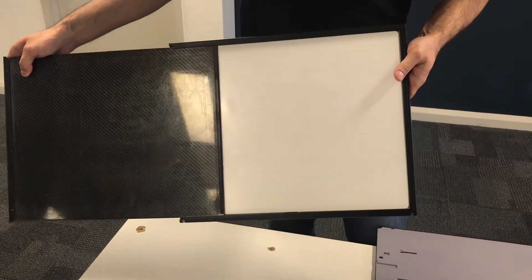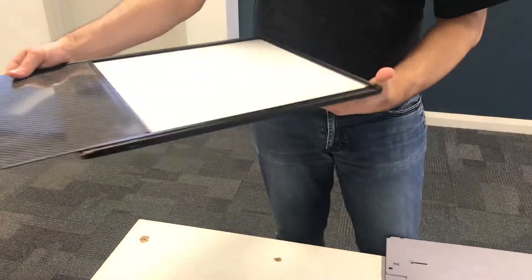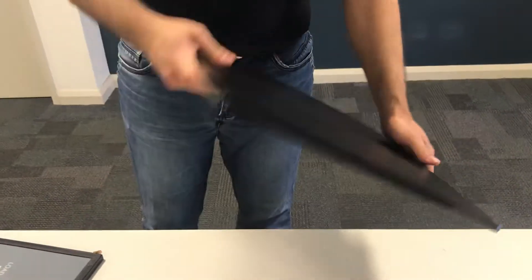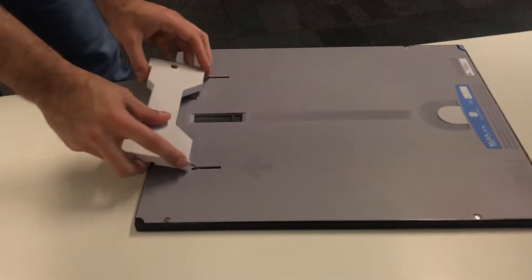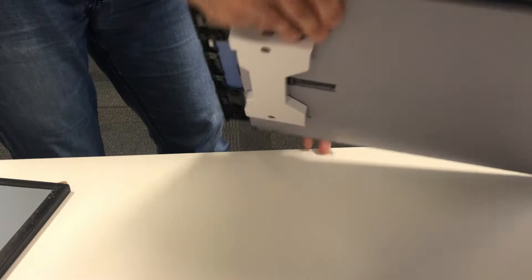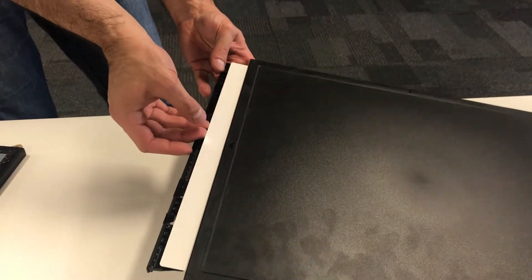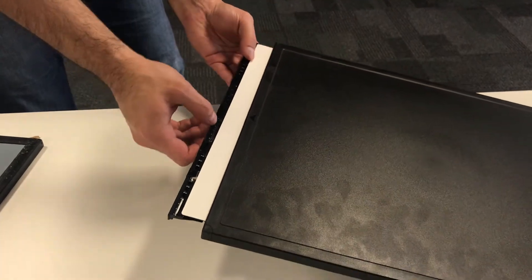The machine opens the carbon fiber cover and scans the plate. On the other hand, the Konica system actually pulls the plate out to scan it — it pulls the plate out just like this, scans it, and then puts it back in the cassette.